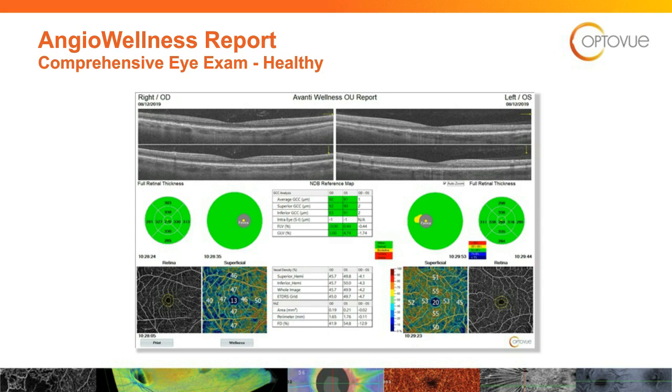I've looked at these enough that the inner circle should be around 46 to 53, and then high 40s, low 50s in that outer ring. And it's always thicker nasally than temporal, as it's depicted there on both of those patients. So that's about as long as it takes to go over it with a patient, and obviously there are some questions on it.